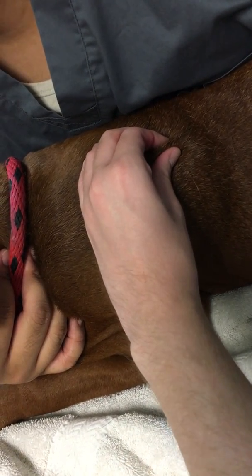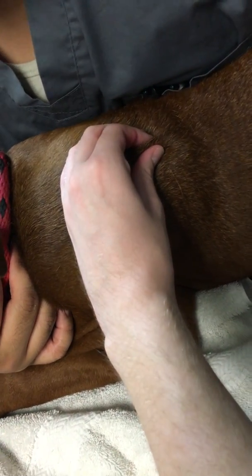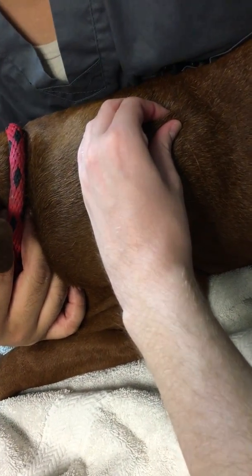Hold it for about 30 seconds — 30 seconds to a minute is best. If you let go at 30 seconds and it's still leaking, hold it for another 30 seconds.